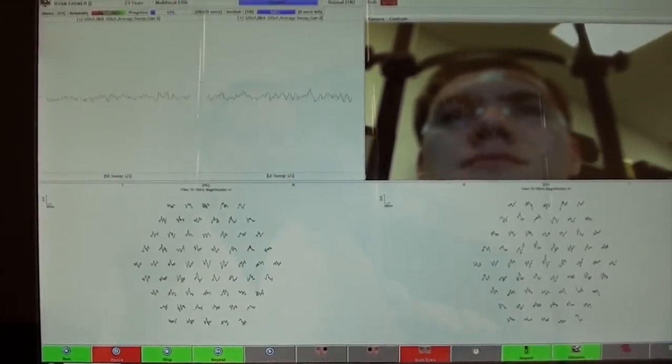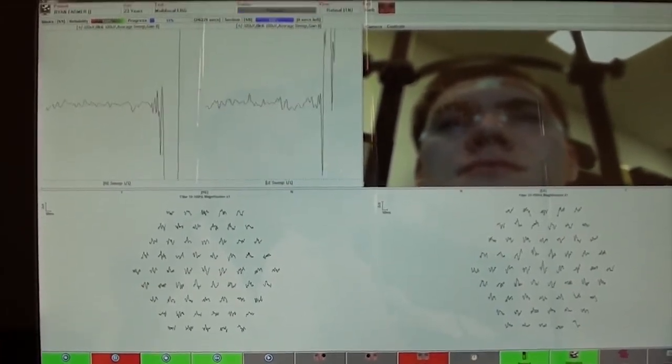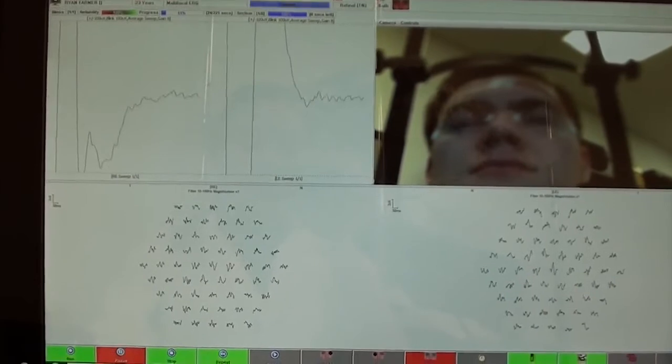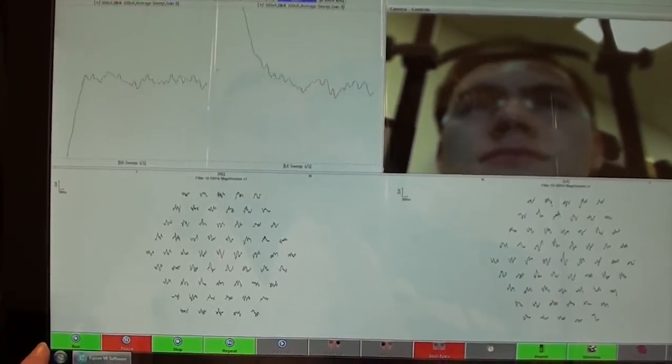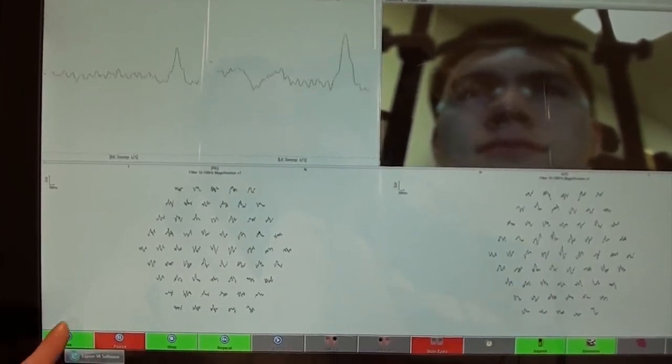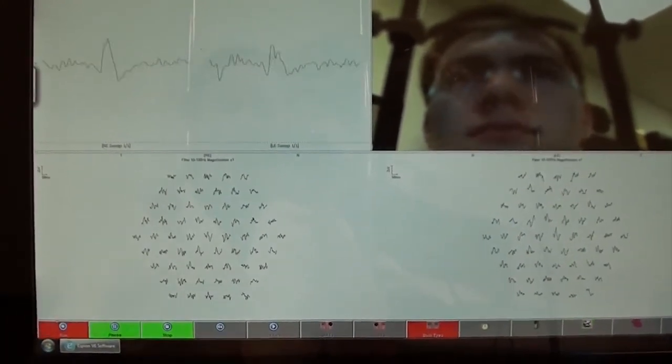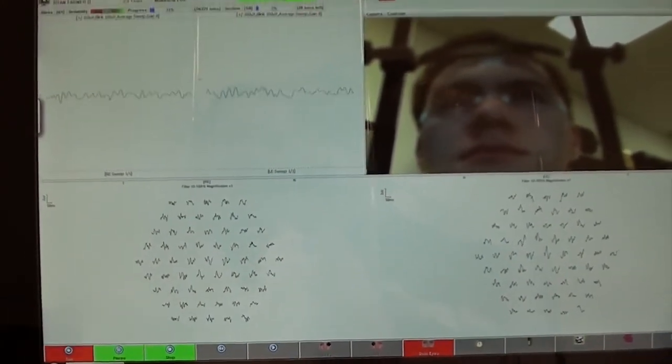We ask our patient to blink. Three, two, one. Click run to continue going on with the test.